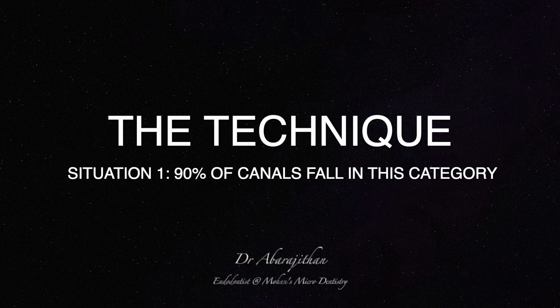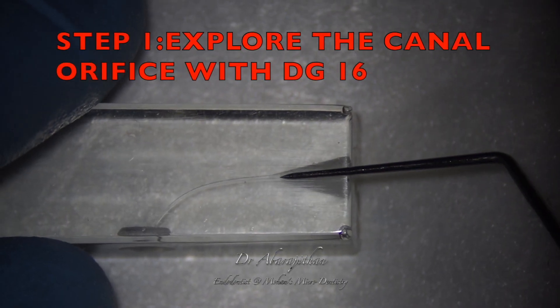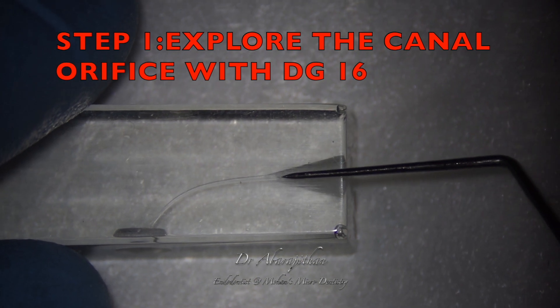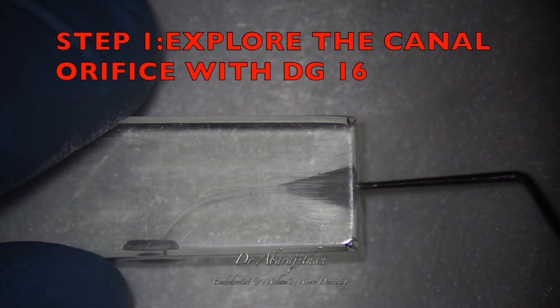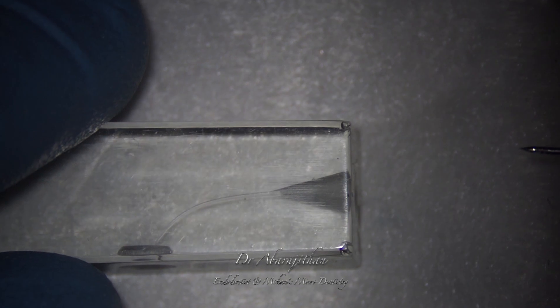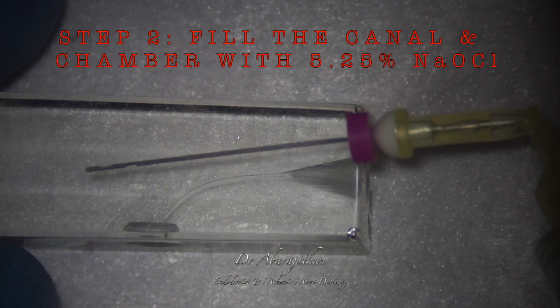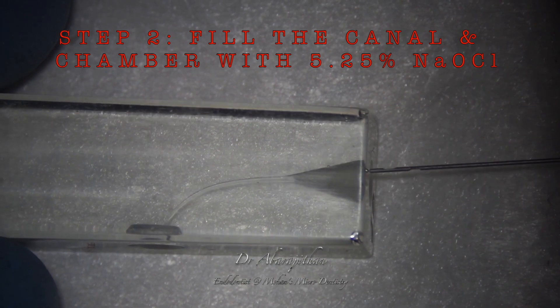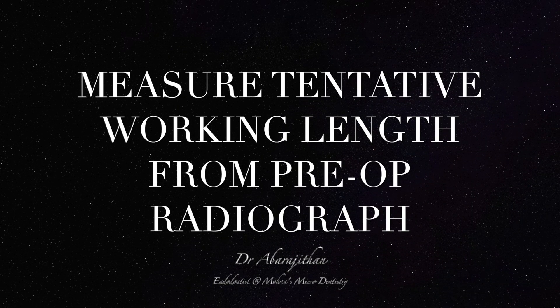Situation number 1, which is what we will face in day-to-day practice. We will explore the canal orifice with the sharp DG16 rather than locating the canal orifice with the hand file. Once confirming the canal orifice with the DG16, we will place a few drops of 5.25% sodium hypochlorite in the canal passively, making sure the pulp chamber is also loaded with hypochlorite.